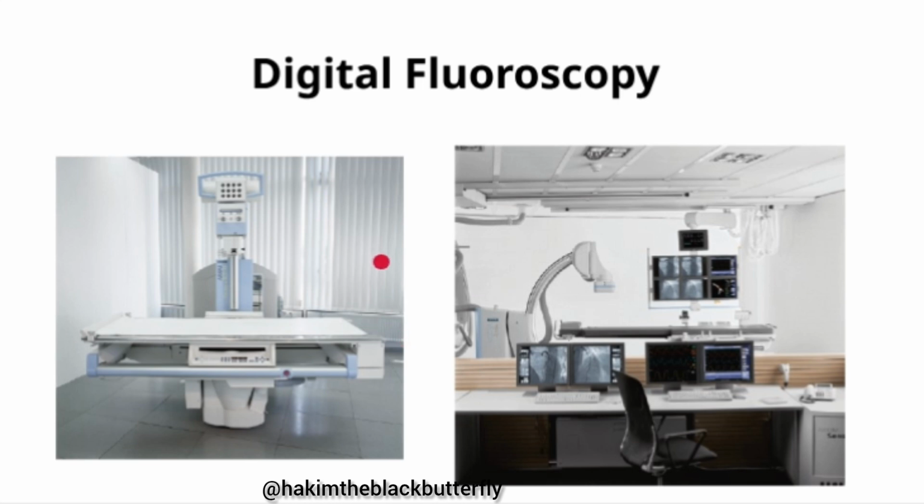Because now with digital fluoroscopy, we can do what we call post-processing. We can always adjust the image qualities after retrieving them, or even before storage. We can adjust the parameters, or maybe the contrast is not good, or maybe we want to truncate off some areas. We can always do it in digital fluoroscopy.